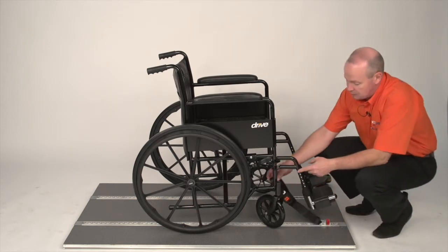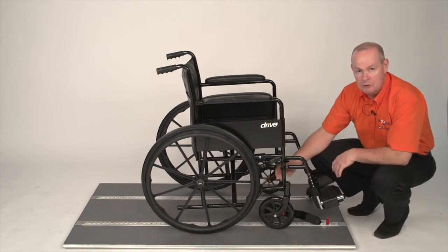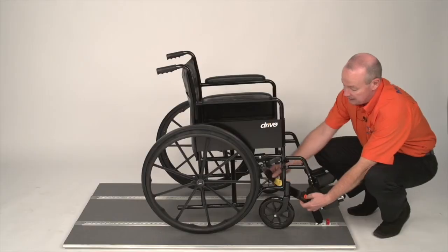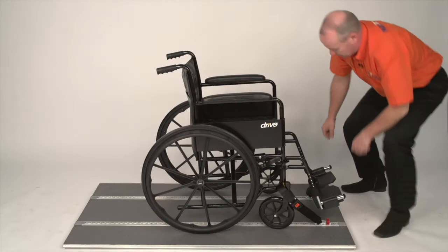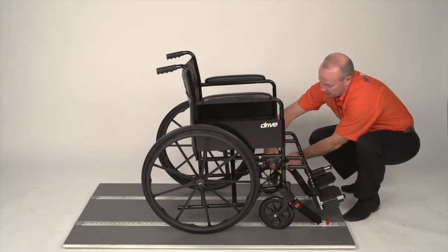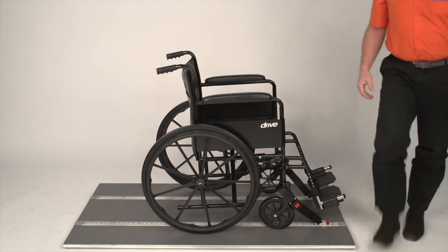We then have to secure the strap onto the wheelchair onto what we call the mainframe. The mainframe is where the horizontal and vertical bar meet. The strap will be undone, coming from inside to out, tongue back into the buckle. Do the same for the other side — inside to out, back into the buckle.